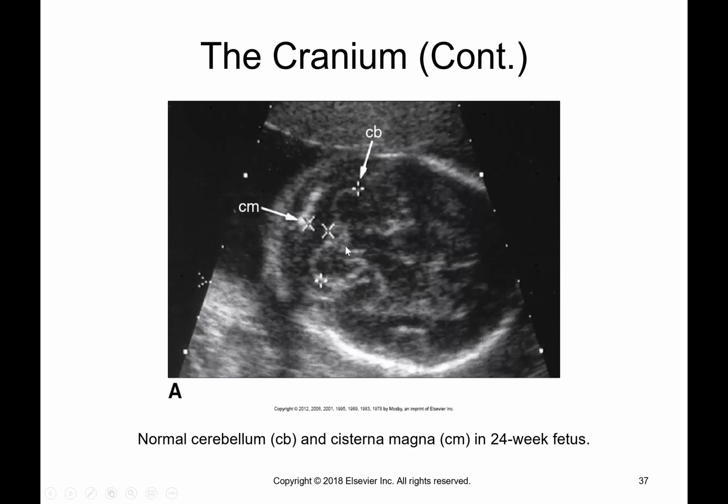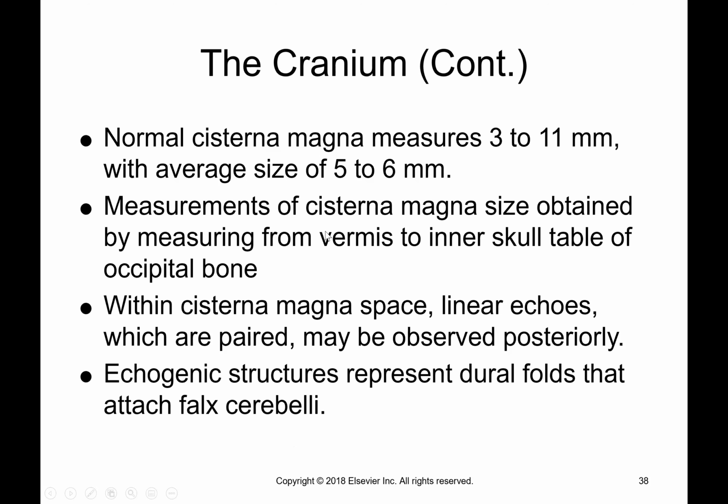This is the cerebellum measurement, and then this is the cisterna magna. Oh, 3 to 11, yes. 5 to 6, okay. I don't like this 11. We cut off at 10, just FYI.